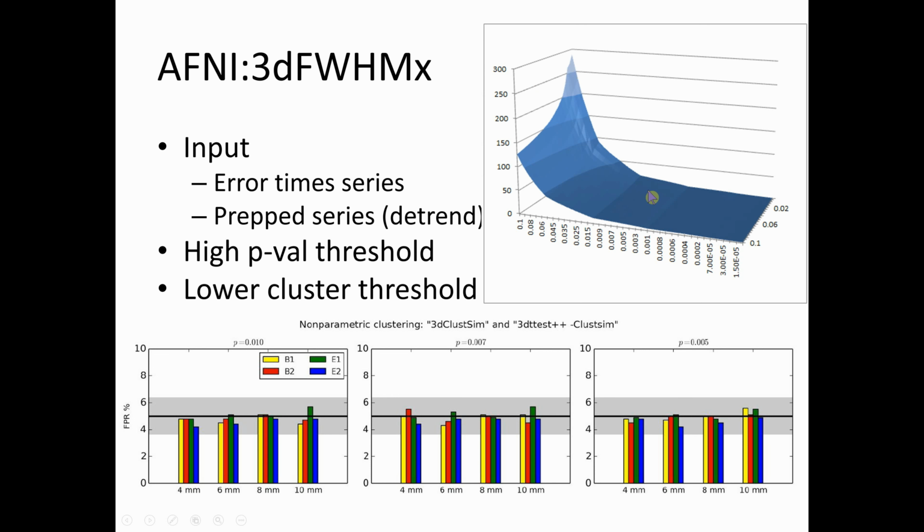Once you get a more controlled p-value range, you have a consistent level of where you expect those clusters to come out. And you get a more localized, usually a lot smaller cluster, often in the range of, I'm going to say, 5 to 20 voxels. It depends on the size of your cluster, your resampling and such.